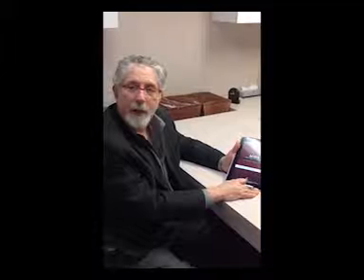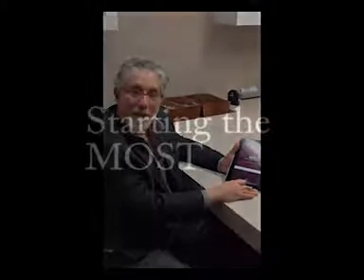The MOST takes less than 5 minutes to administer and score, and in the case of the iPad version is going to yield a report that you're going to be able to integrate into the patient's file. So let me tell you a little bit about this in different sections that you can click on as we go along.